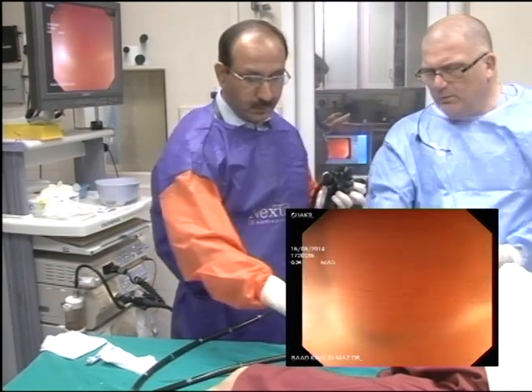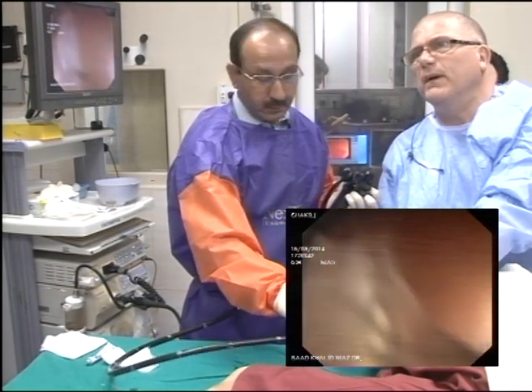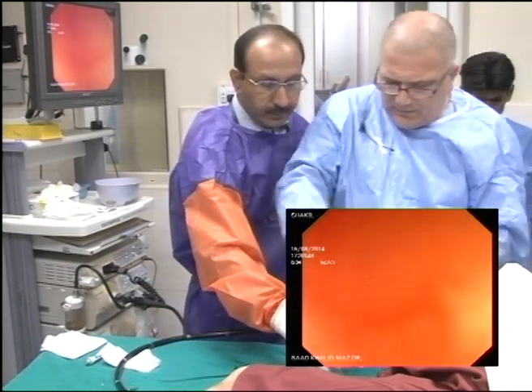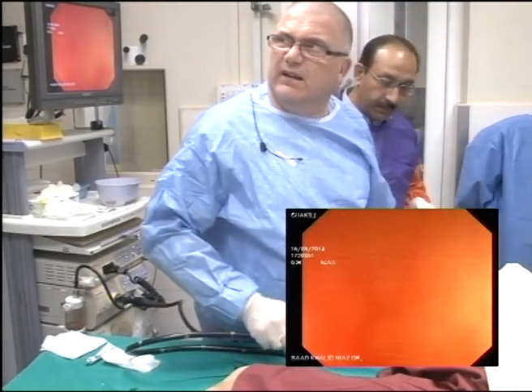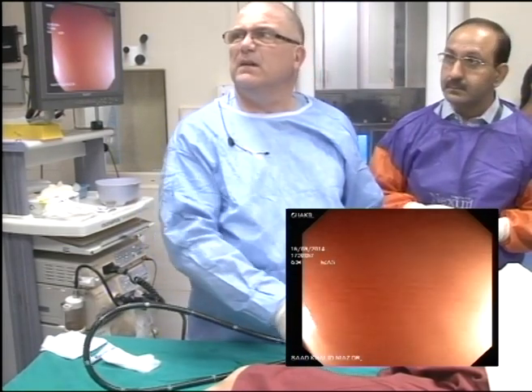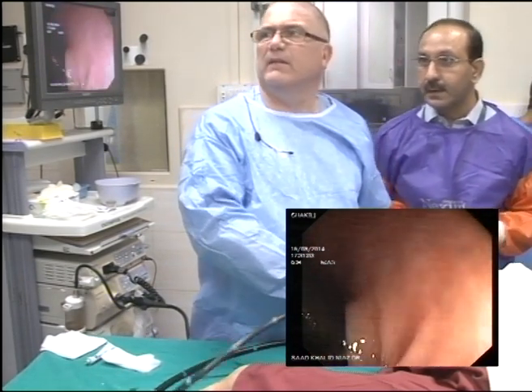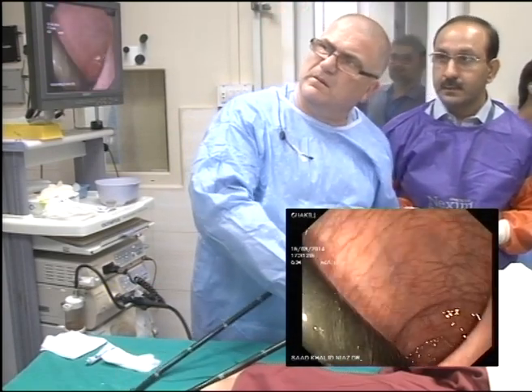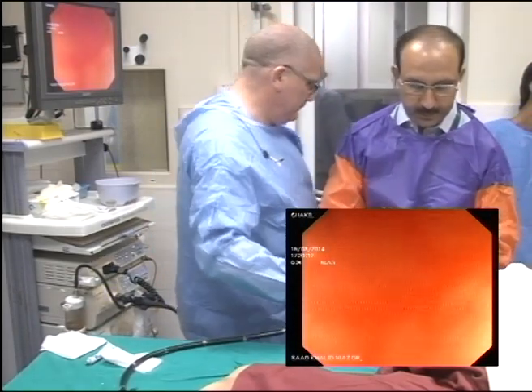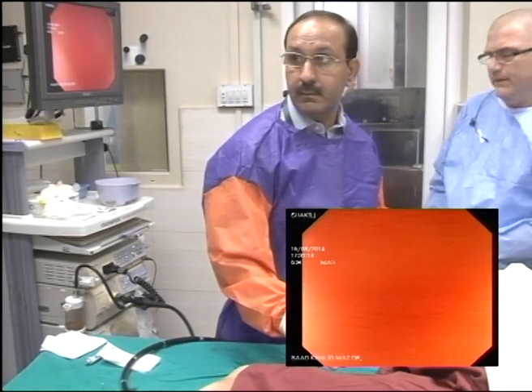Now rotate the scope this way. Let me show you, because you've got it right. You're back, and you're back. Okay? Keep it down in a straight line. And then let the scope come back round. See it? And then there. Yeah? And then take the scope out. Excellent.